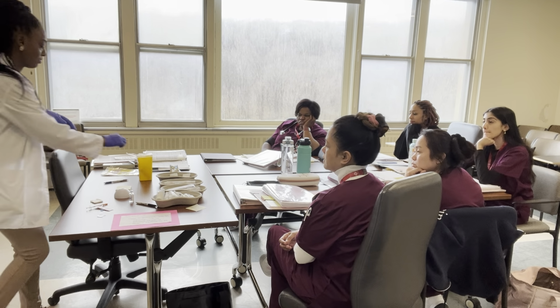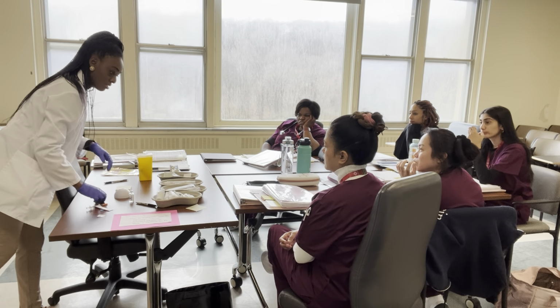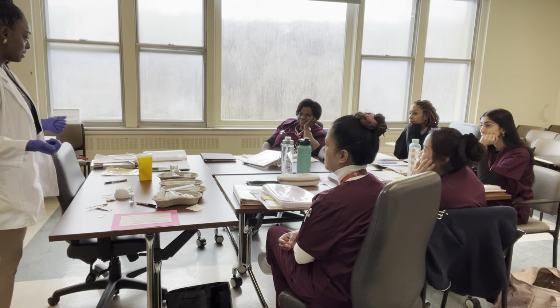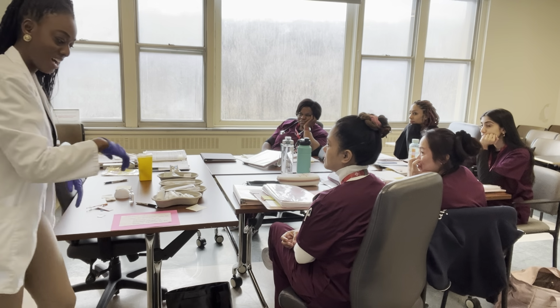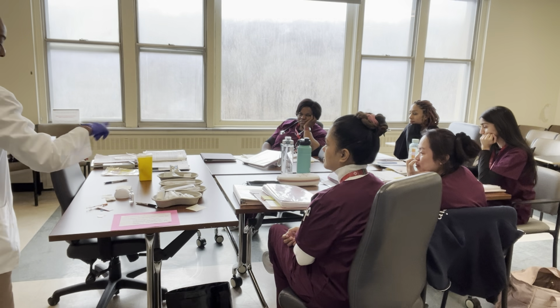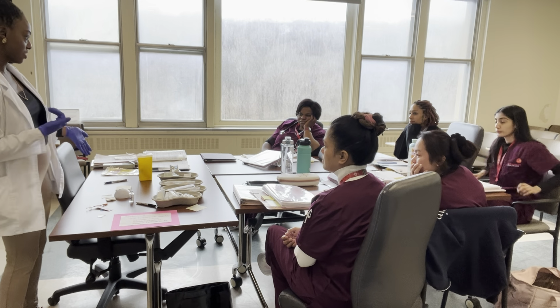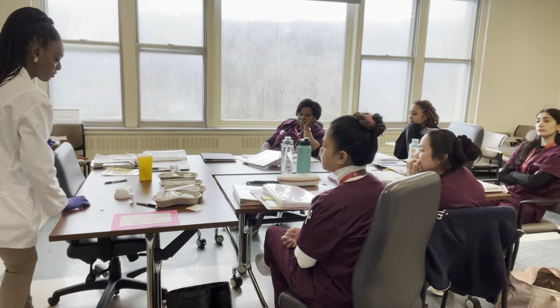Okay? So you go into the room. I forgot to check that. Ah, good. She learned. And that's what I see people doing, they just go in and give the med. So you check the patient's ID. Anna is my patient, so check the ID. Oh, okay, Anna, and then her first and last name. And then I get ready. I let them know what I'm going to do and prepare for the injection.